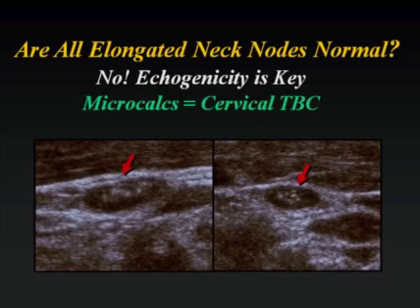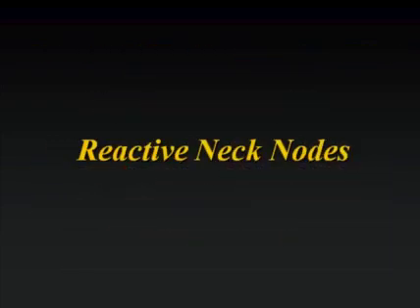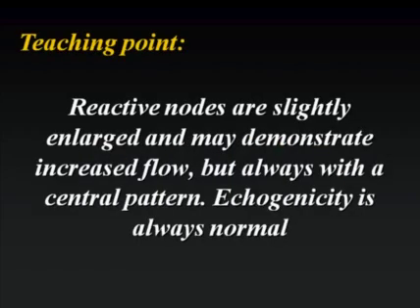Now, microcalcifications are not, strictly speaking, specific for papillary cancer, although in the post-thyroidectomy patient, we rarely encounter anything else. But depending upon your patient population, cervical tuberculosis with granuloma formation may cause microcalcifications again, but that's a very rare phenomenon indeed.